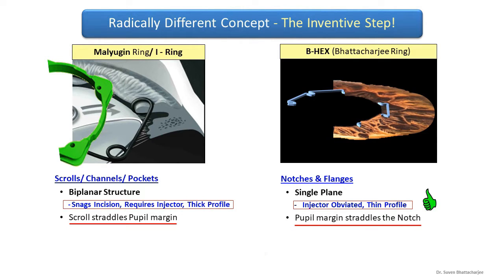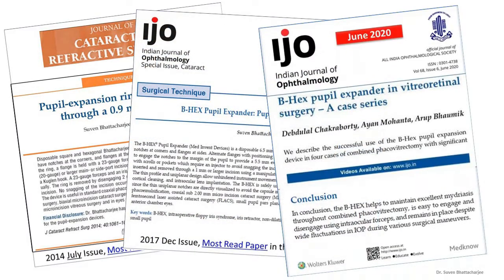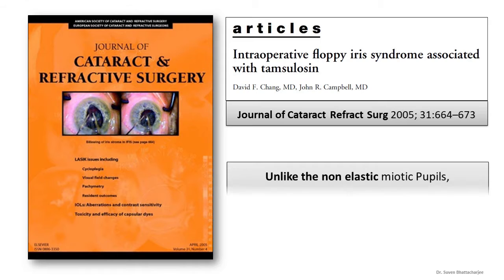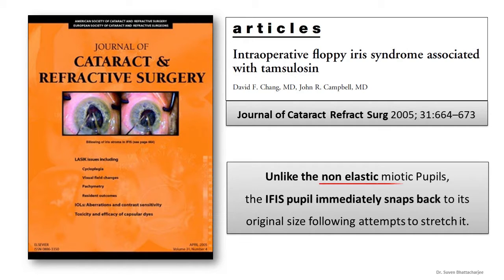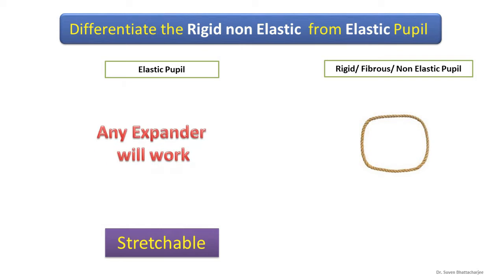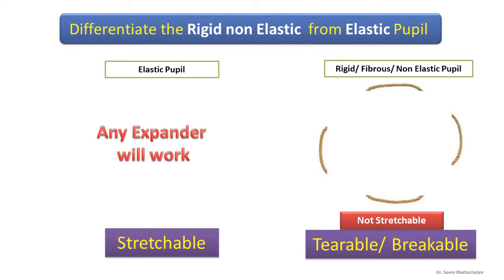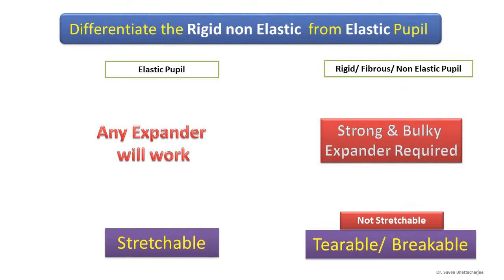The iris bends harmlessly and reversibly at the notches while the BHEX remains in a single plane. Publications have endorsed its usefulness in difficult cataract and vitreoretinal surgery. Chang and Campbell published that unlike non-elastic pupils, the IFIS pupil immediately snaps back when stressed. So we have an elastic pupil which is like a rubber band — any device will work — whereas the non-elastic pupil is like a string and can only be torn or broken, requiring a strong and bulky expander.